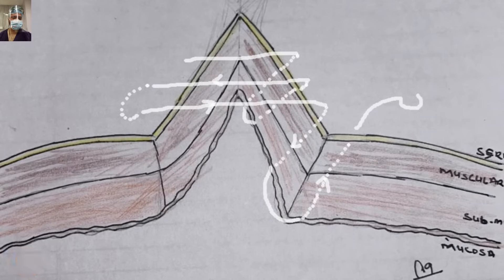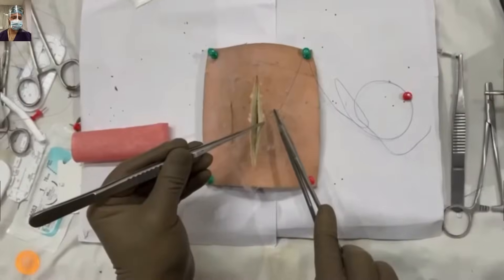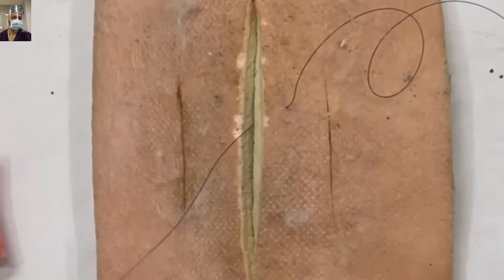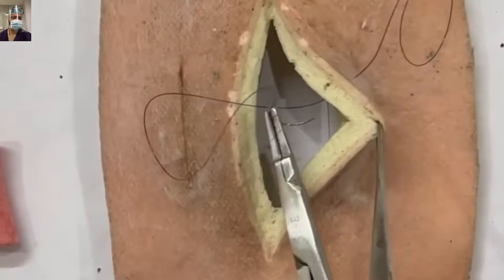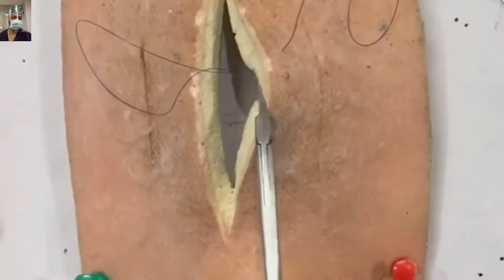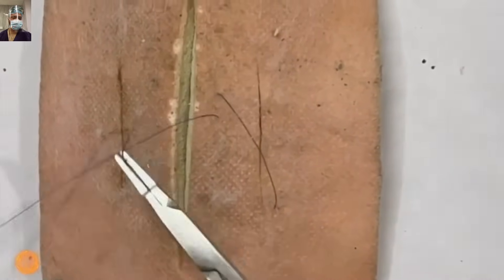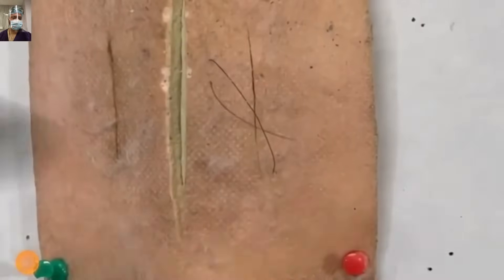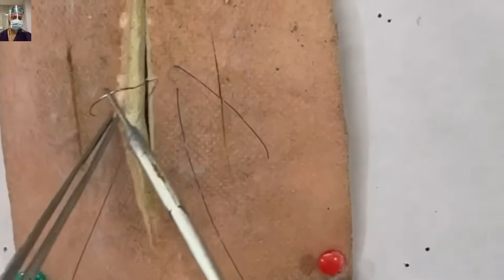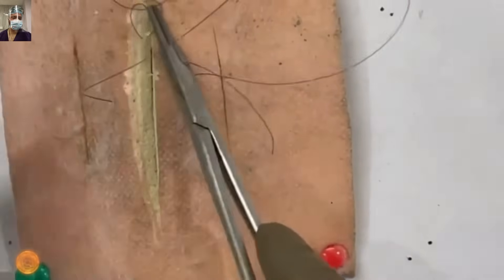We are now demonstrating the corner suture. Here we have gone through and through — we enter part of the inside of the gut lumen and then come back out. It is a parallel suture, and the basic difference between these two techniques is that we are taking part of the mucosa in the corner suture. How to hold the needle and how to use wrist movements have already been discussed. Watching this whole series will help give you a smooth induction into the field of suturing.